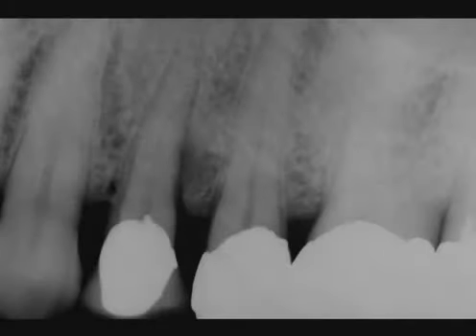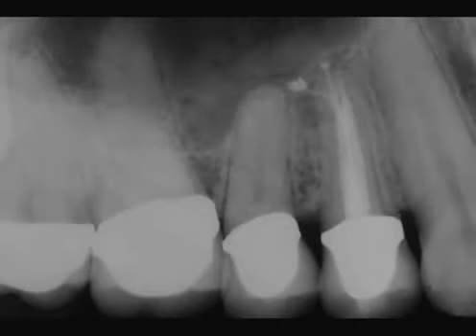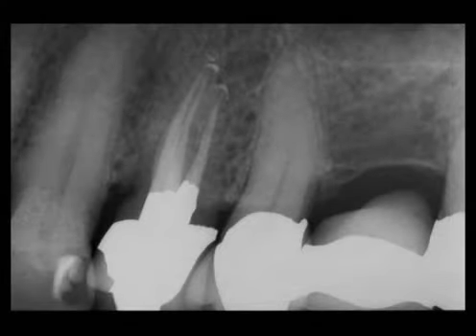Maxillary first bicuspids generally exhibit 2 roots and related root canal systems. The clinician should anticipate multiple portals of exit over the length of the canals. Some of these systems have deep divisions. Fused roots oftentimes have ribbon-shaped orifices. Within the body of the canal there can be deep divisions. At times, maxillary first bicuspids can have an MB, a DB, and palatal roots.